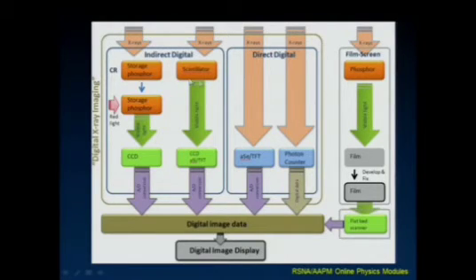There's another indirect approach that uses a scintillator instead of a phosphor, and some of the flat panel detector systems use this. Remember, these give off light immediately. You don't stimulate them. So they're not useful for doing a portable X-ray and coming back down to read that, right? The image has to be read off as it's being exposed, if you will. And that's still done. That high energy X-ray is converted to visible light that's then read by an amorphous silicon or thin film transistor array CCD camera.